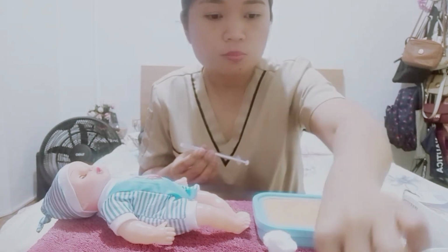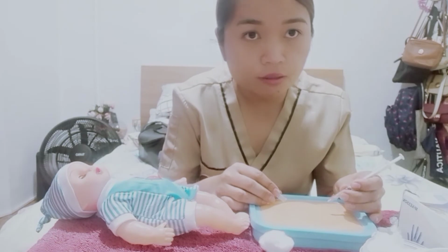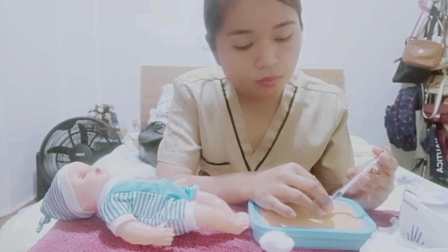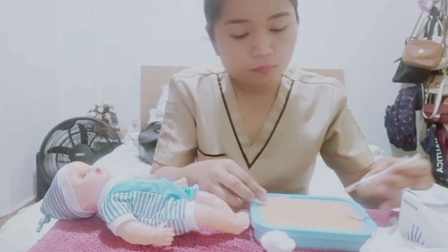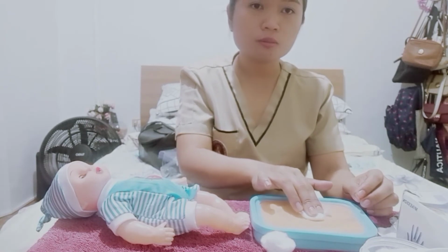So let's just pretend we clean the area. Okay, so 45-degree angle. And then we are going to administer the medication. And then we wipe it with the dry cotton balls.